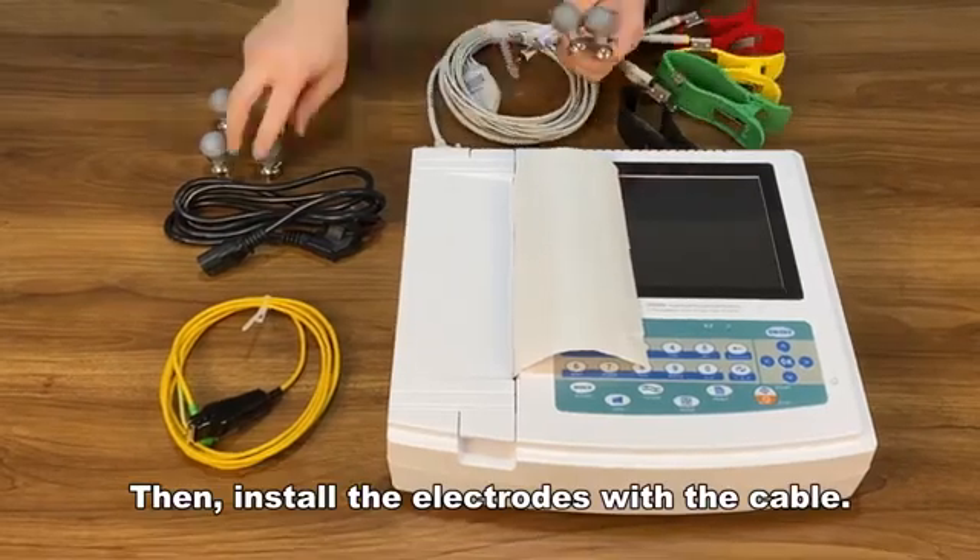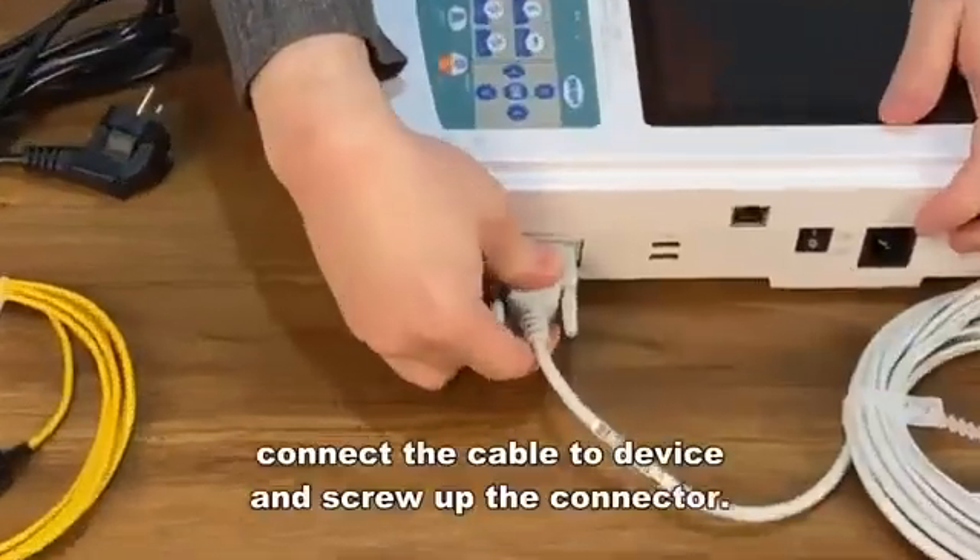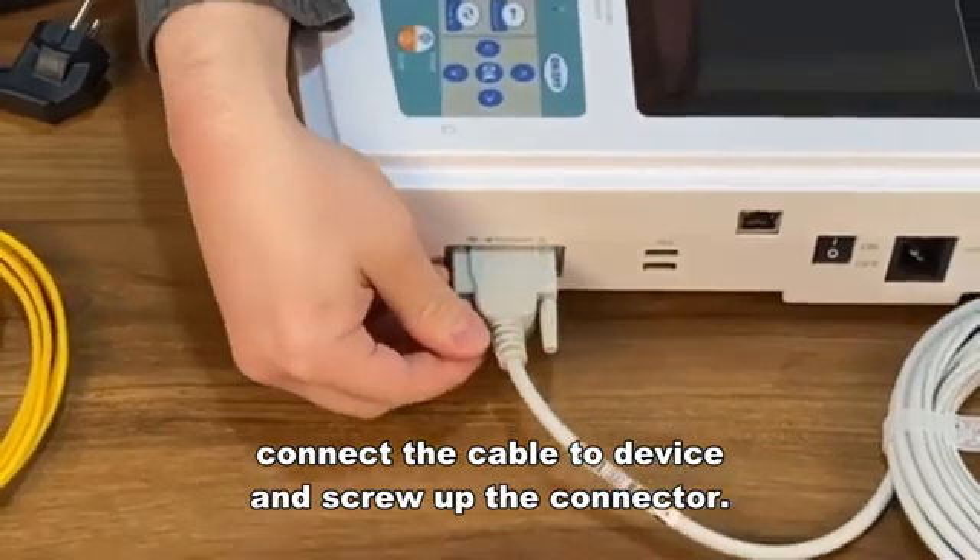Then install the electrodes with the cable. Connect the cable to the device and screw up the connector.